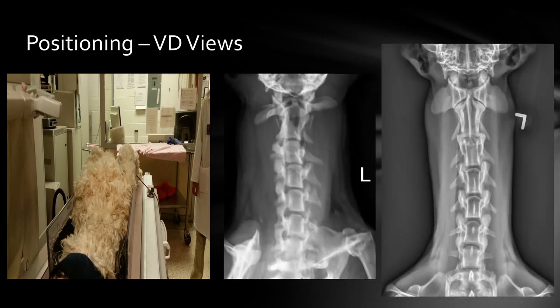For the VD views, and I apologize, this was the only radiograph I had for that. For the cervical spine, we do want the legs pulled backward and the neck stretched out as much as we can. So the dog's head is down here. This is a sandbag. We use V troughs for VD views to accomplish straight positioning. What we do not want is a radiograph that looks like that.